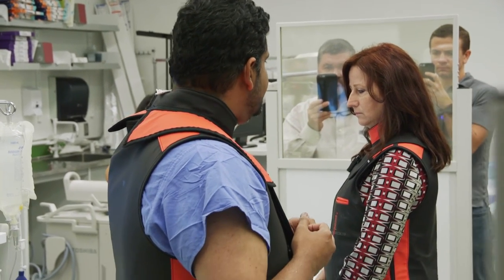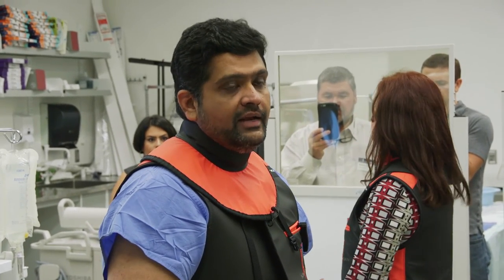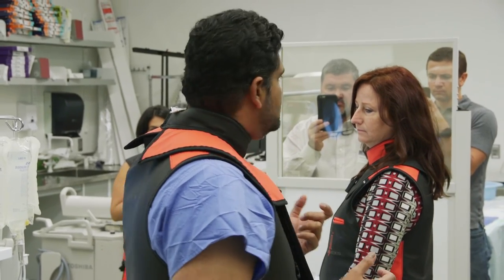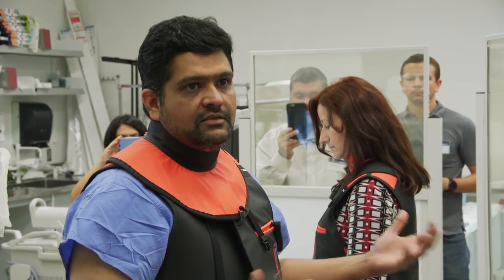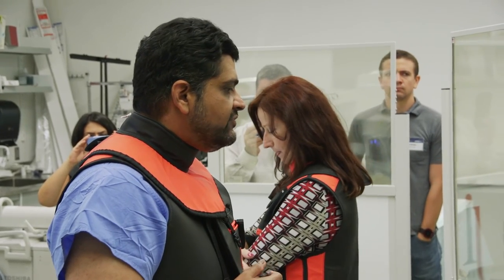We're going to be presenting this at TCT in two weeks' time, showing the rest of the world how we think 3D printing is helpful. For me, I will not do any more native mitral cases without 3D printing. It's risky enough that you want to give yourself the best odds of success in a case like that. We think it's very helpful.